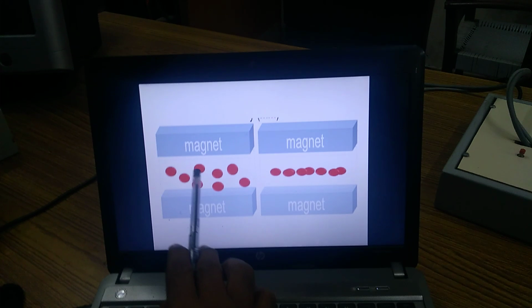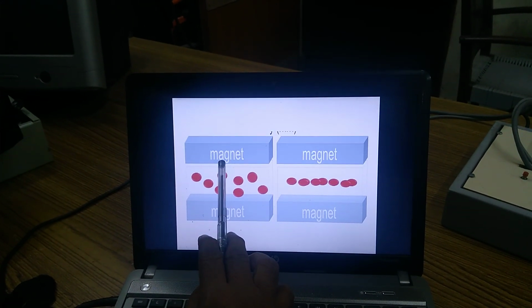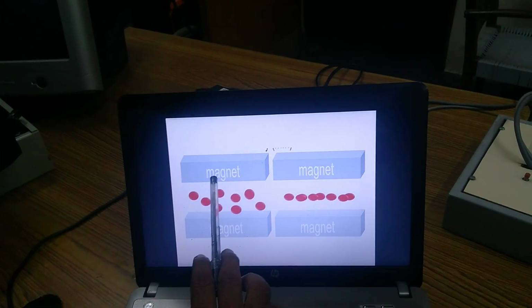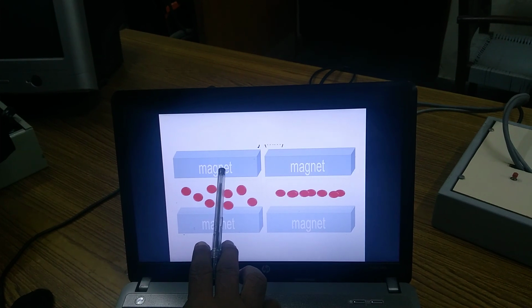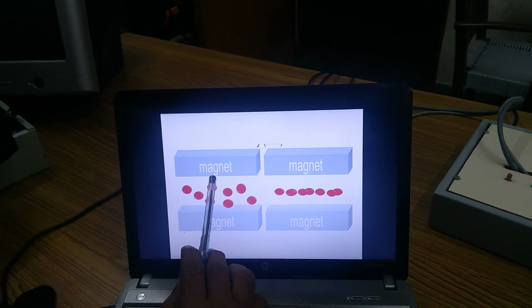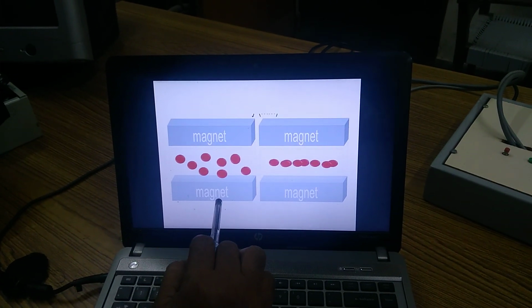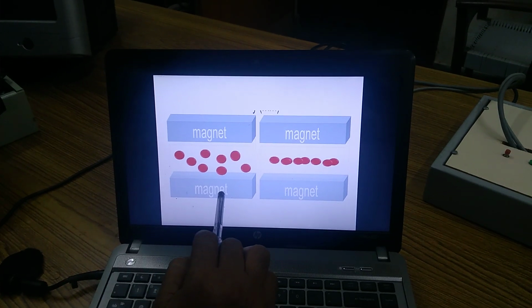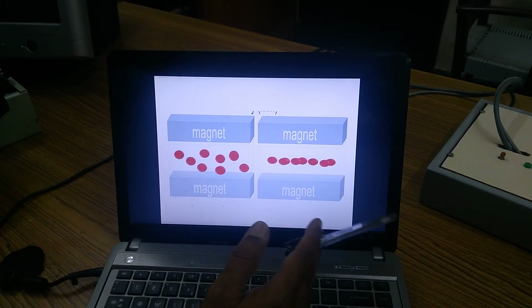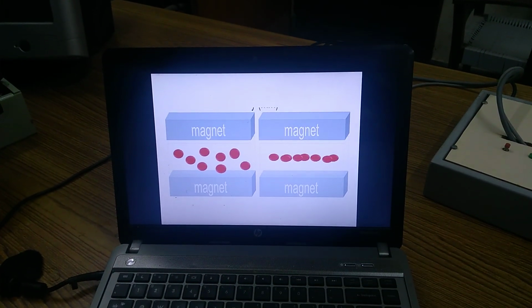Whereas with normal blood cells, in the anemic cases the RBCs will be fewer, and there are certain gaps. On one side an LED light will be there, and on the other side we are measuring the absorption. As the gaps are there, the light can pass through and reach the sensor. This particular property we also adopted in order to differentiate sickle cell from normal anemia.